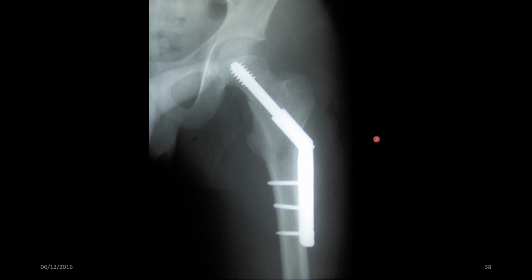We put these in under fluoroscopic guidance. All the surgeons do. So they make an incision here and down here, and then they drill into the hip. First of all, they manipulate the limb. They put 2 K wires in to stabilize the fracture. They drill up here, put the screw in, and then put a plate in. And there you go. That's how they fix a proximal femur fracture.